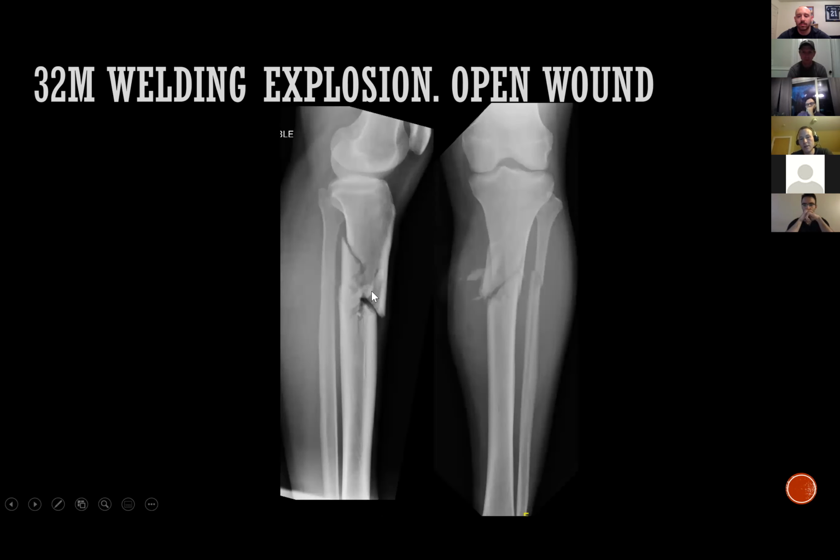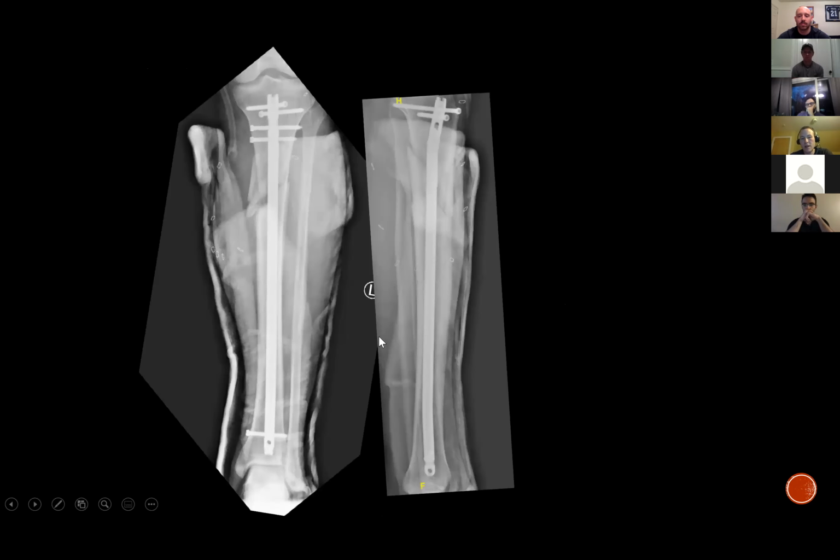This fracture could shorten on itself. So we need more stability. This one only has one screw. This is a bad example because I remember who did this. Typically, if a fracture can shorten on itself, we would want more than one screw here. I apologize for using a bad example.